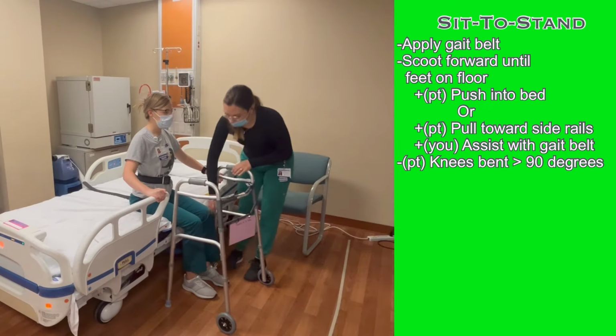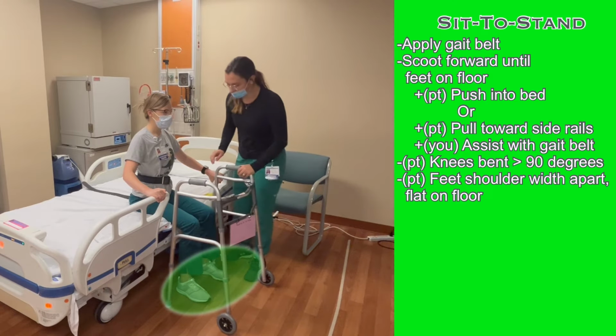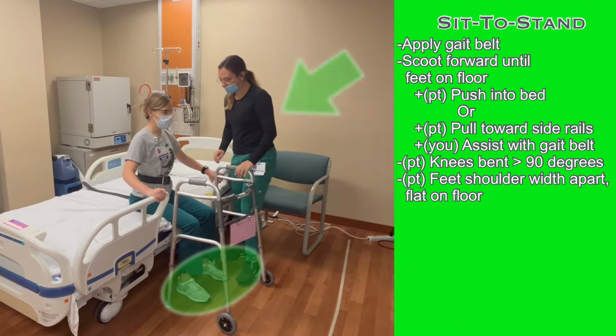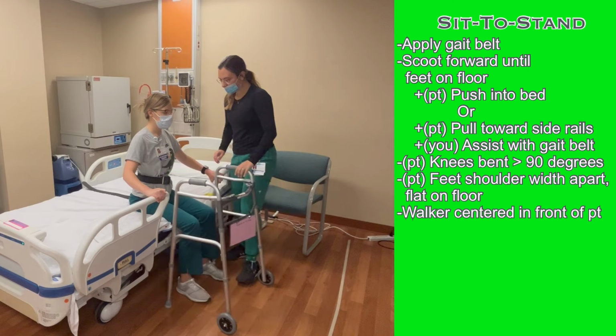With your patient at the edge of the bed, make sure their feet are resting completely on the floor, shoulder width apart. Always stand to one side of the patient, never directly in front of them. Bring the walker into position in front of the patient, with the patient centered behind it. The next step is for the patient to stand.